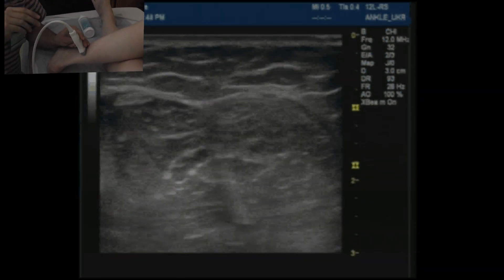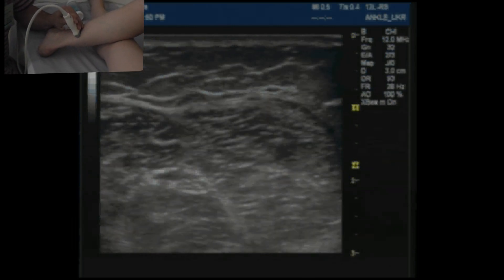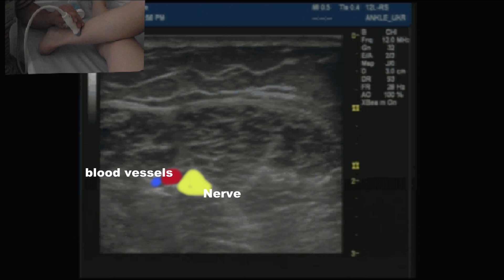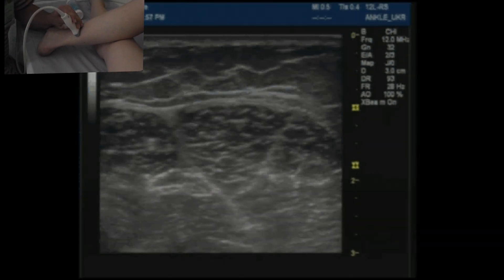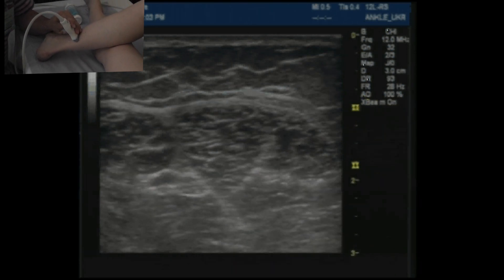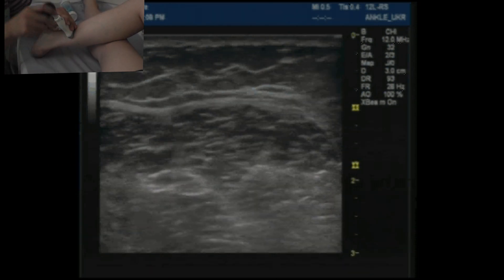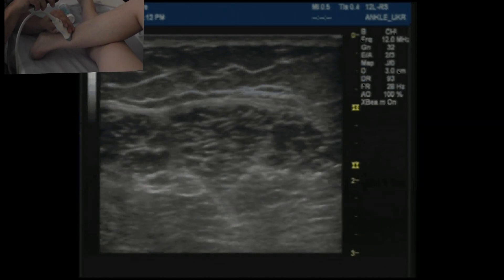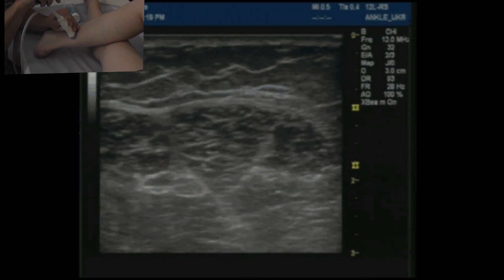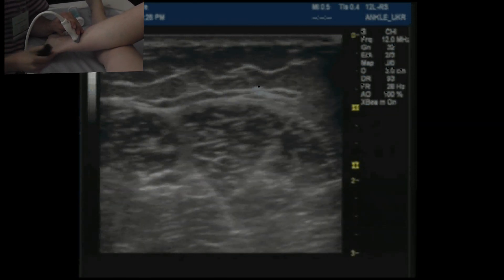I know from having scanned Sarah earlier that the tibial nerve is best visualized slightly more proximally up her leg, and you can see it as this triangular structure just posterior to the vessels here. You can see the margins of it very nicely and clearly — it's most commonly a fairly triangular structure. We bring the needle in from a posterior approach, so you'd expect to see it approaching in this direction, coming down to the bottom angle, then infiltrating posteriorly and anteriorly, usually using somewhere in the region of five mils to get a good circumferential spread.